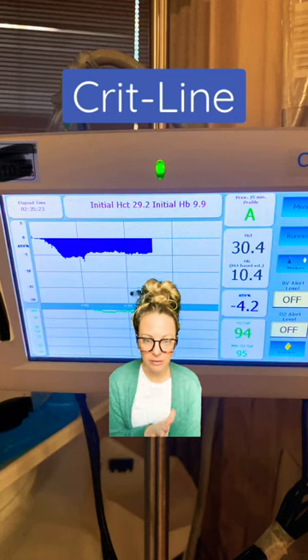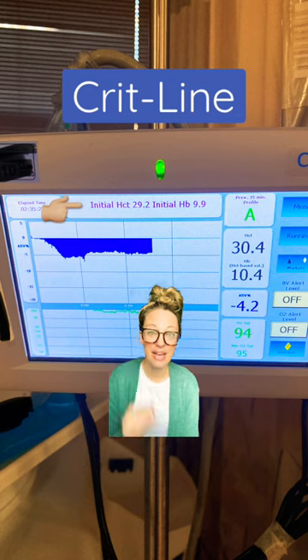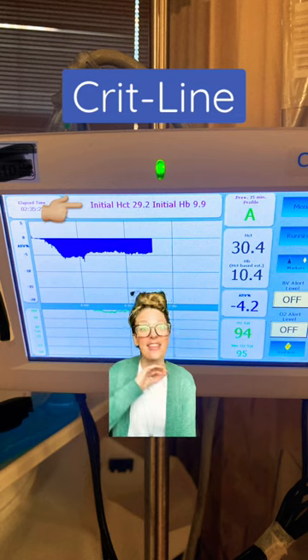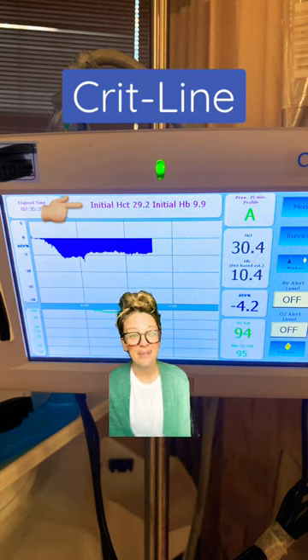Crit lines tell us so much information, so we have to start somewhere. Let's start with the initial hematocrit and hemoglobin — that is the estimated blood levels of the patient at the start of treatment. Here we have 29.2 and 9.9.